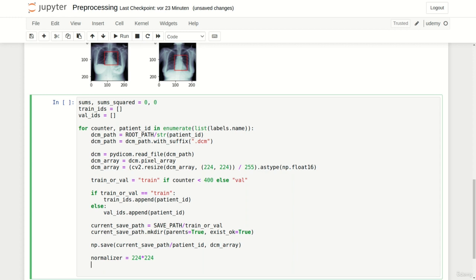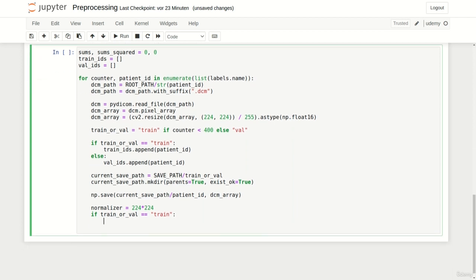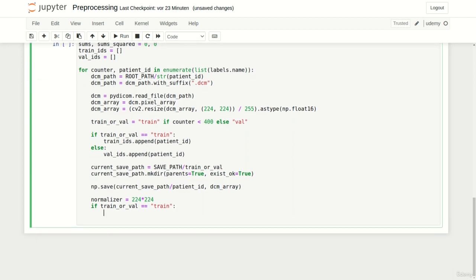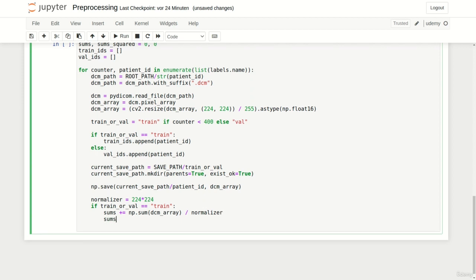Next we check if our train or validation string equals to train to finally update at first sums by computing the sum of the current dicom array with subsequent division by the normalizer. sums_squared is updated by at first squaring our dicom array with subsequent sum computation. Of course we also divide it by the normalizer.